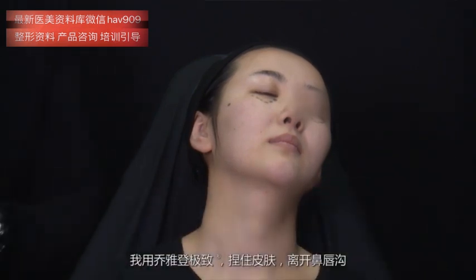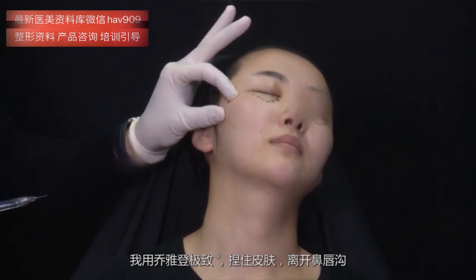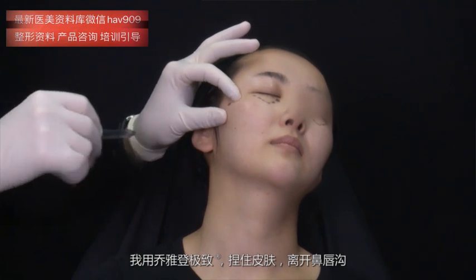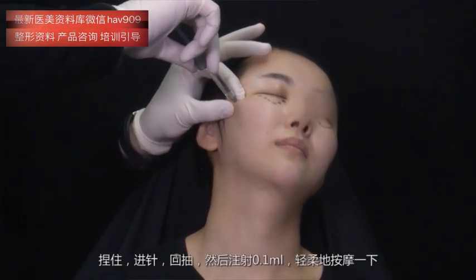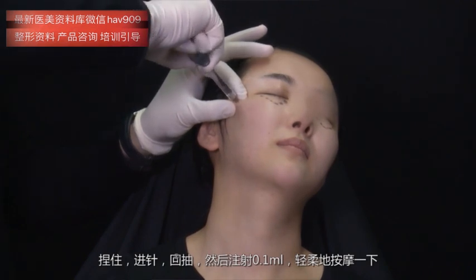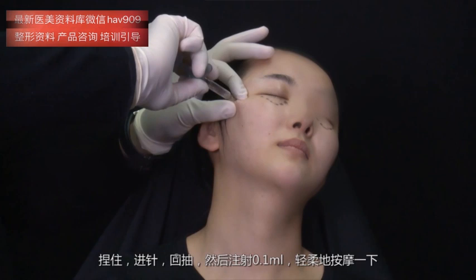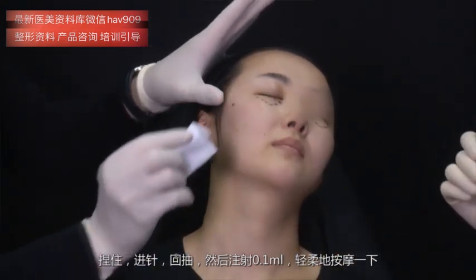I get Juvederm Ultra Plus. Pinch and retract the skin so that I lift the nasolabial fold. Pinch, go deep plane, aspirate, and we inject 0.1 ml. Gentle massage.